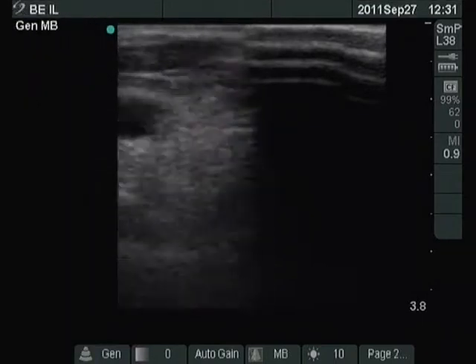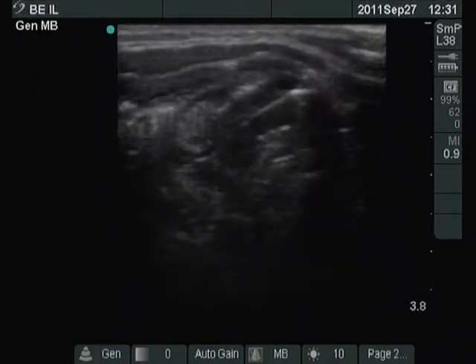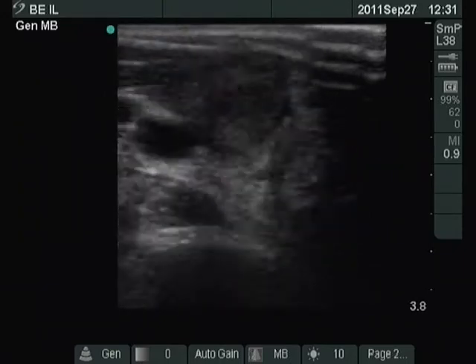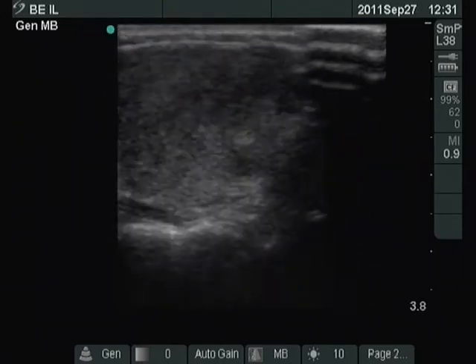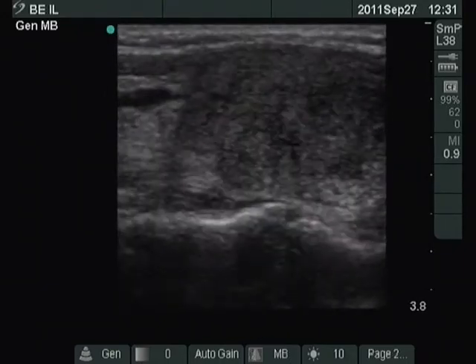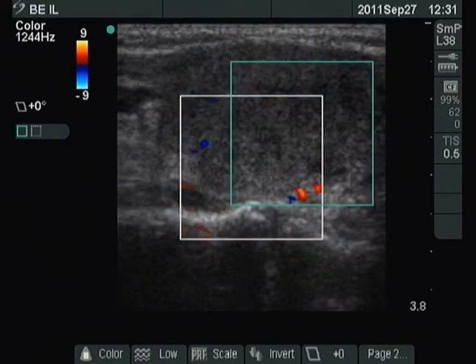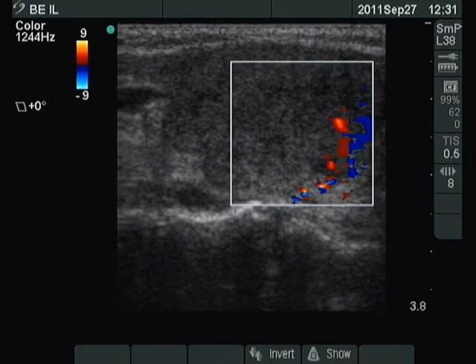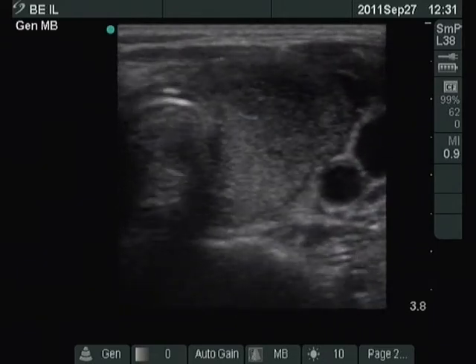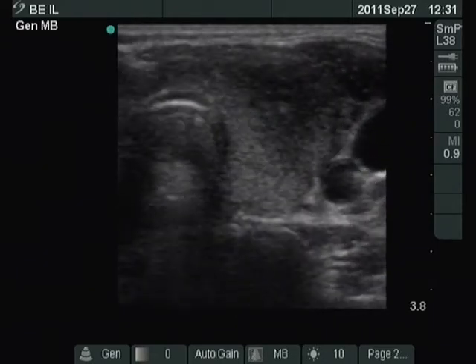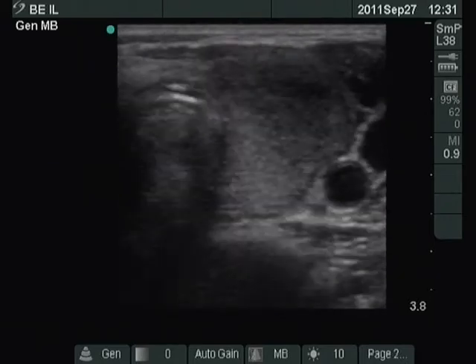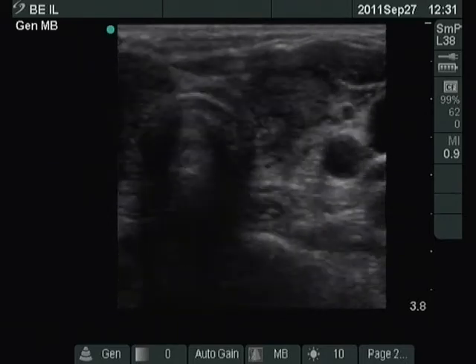The right lobe and the horizontal view are shown. The pattern on grayscale mode is not typical for subacute thyroiditis. Even Hashimoto's thyroiditis frequently displays such a presentation. On the other hand, the echo pattern is almost pathognomonic in the left thyroid. There is a large hypoechoic area with blurred borders in the lateral part.